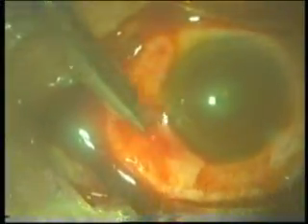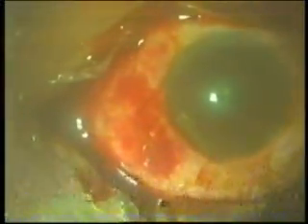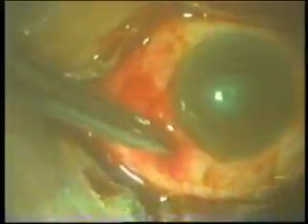We give a wash with betadine, and we remove some fibrinous material which was there in the subconjunctival space. And this is the worm, still alive, in normal saline, moving away under the microscope light. This worm was diagnosed to be of the Dipetalonema species. It was the adult female worm.